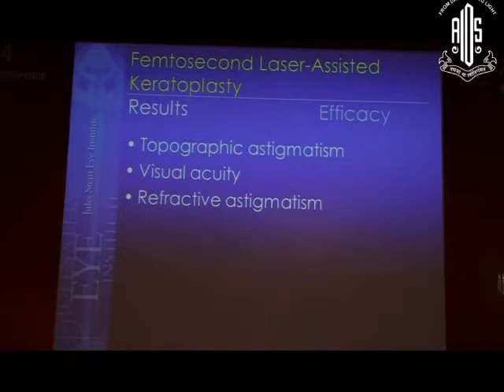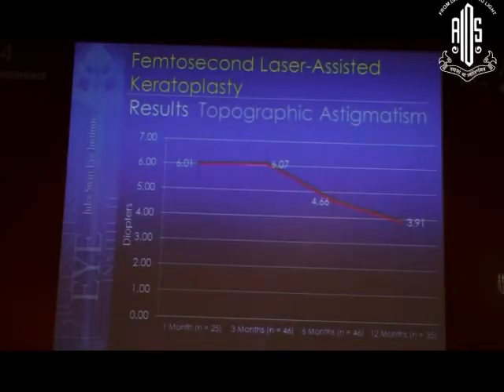In the little bit of time I have left, I want to just touch on efficacy, the other part of evaluating any new technology. Looking at topographic astigmatism first. Here are the results with all of our femtokeratoplasties for all indications. The topographic astigmatism at a month, 3 months, 6 months, and then 12 months.